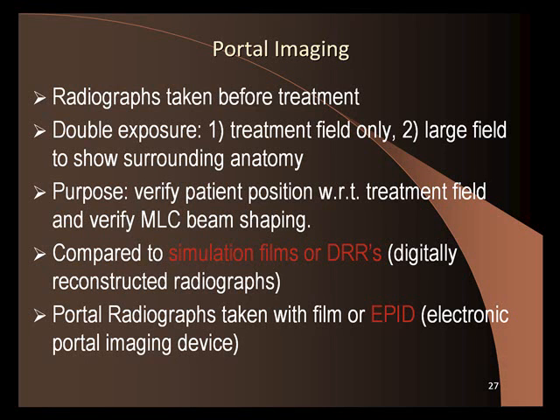Portal radiographs are taken with film or with EPID. You guys heard of EPIDs? Electronic portal imaging device. Most linear accelerators have them. When I talk about portal radiographs, I meant film, but these days we don't use film. So I'm going to draw the gantry here. There's a gantry head.